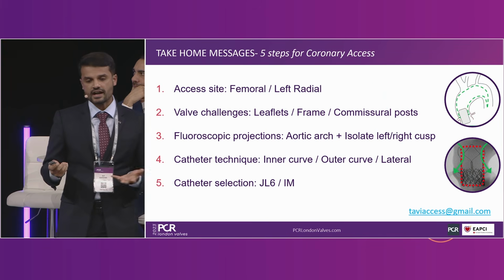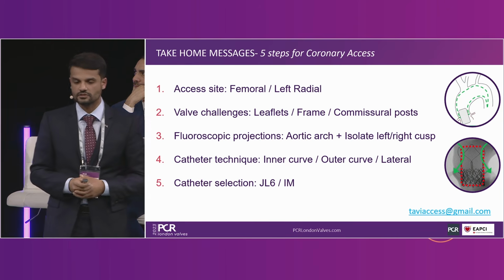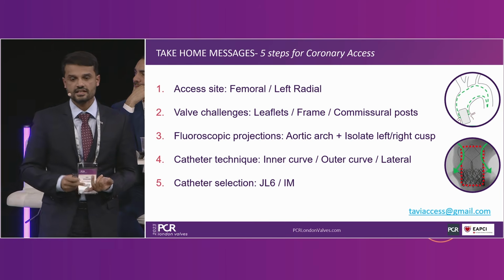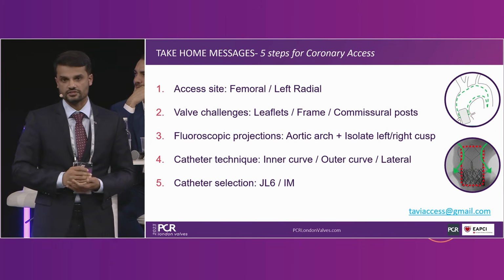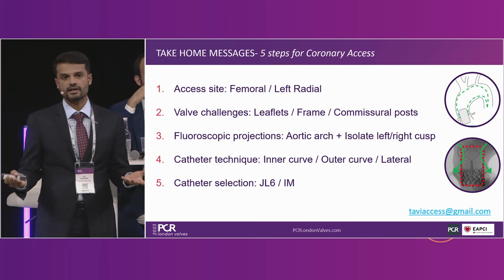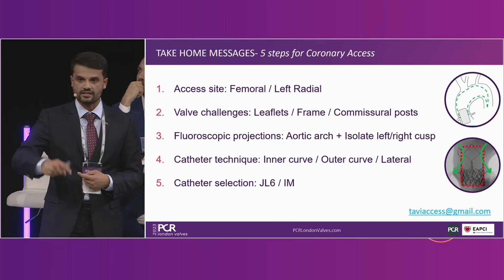So I think 5 take-home messages, really bringing it down to practical things to share with you all. Think about your access. If you have time, you can evaluate the valve challenges that you have in front of you. Use your C-arm and fluoro to see how you can help. Then think about the technique: inner curve, outer curve, lateral. We can be creative with the catheters we use. I have to say, we found the JL6 is very reproducible, very reliable, even for non-expert operators.